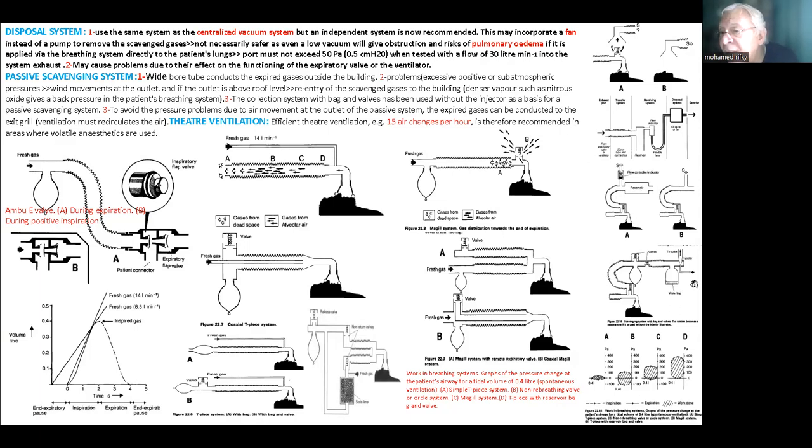And we have here the part showing the Venturi system to induce the flow, increasing the flow. You see, this is the expiratory valve, this is the bag. I'm sorry, this is the mask and the bag. All these are systems to assure that the system has a proper flow without much resistance. And this is a simple method where we can just suck what is present above the expiratory valve by a funnel, as you can see.